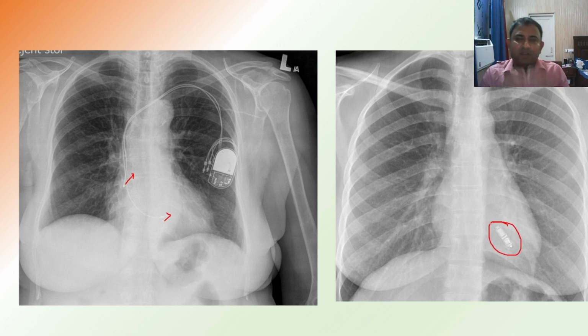This is a very, very small pacemaker put into the right ventricle, where it is both sensing and pacing. The pacing spikes which Micra gives can be more physiological by making it pace near the bundle of His. So the contraction of the heart will be in a more physiological manner.